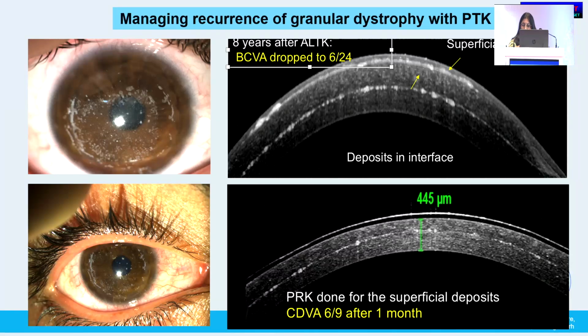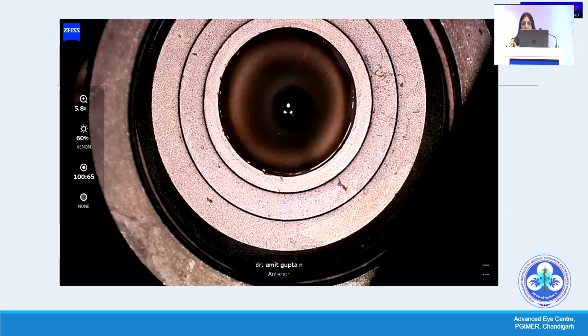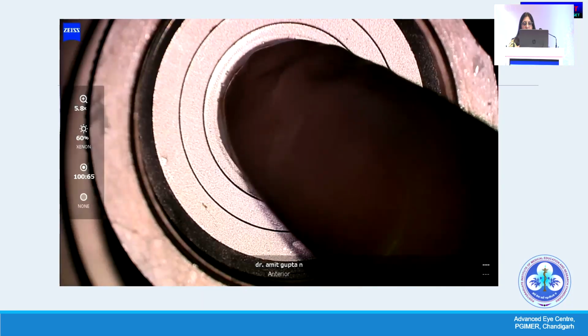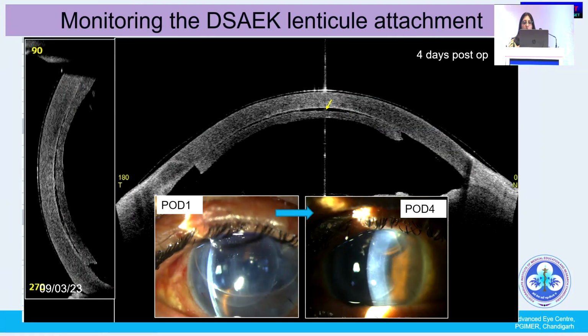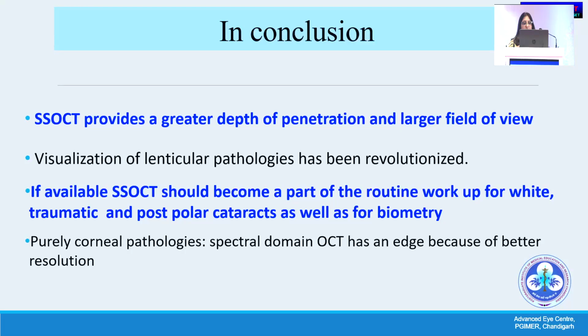Similarly, for endothelial keratoplasties, I'll just take a few seconds more. I'll run through this video. We can monitor the attachment of the DSEK lenticule, and we can monitor how the graft is improving over time, the thickness improving and the clinical picture improving.